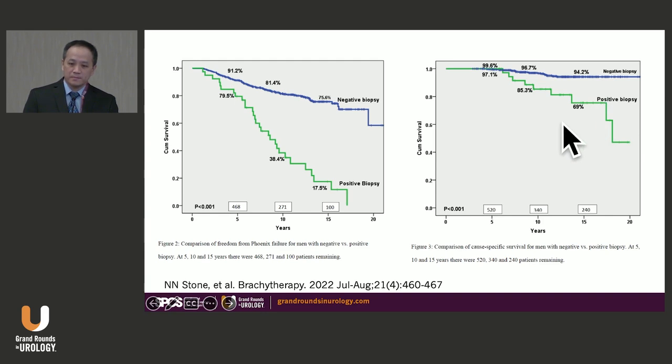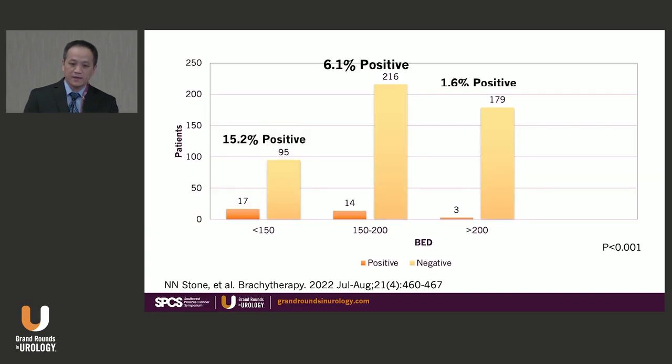So the negative biopsy is a good surrogate for us to see if this dose is enough. In this study, we looked into the dose level in different groups.